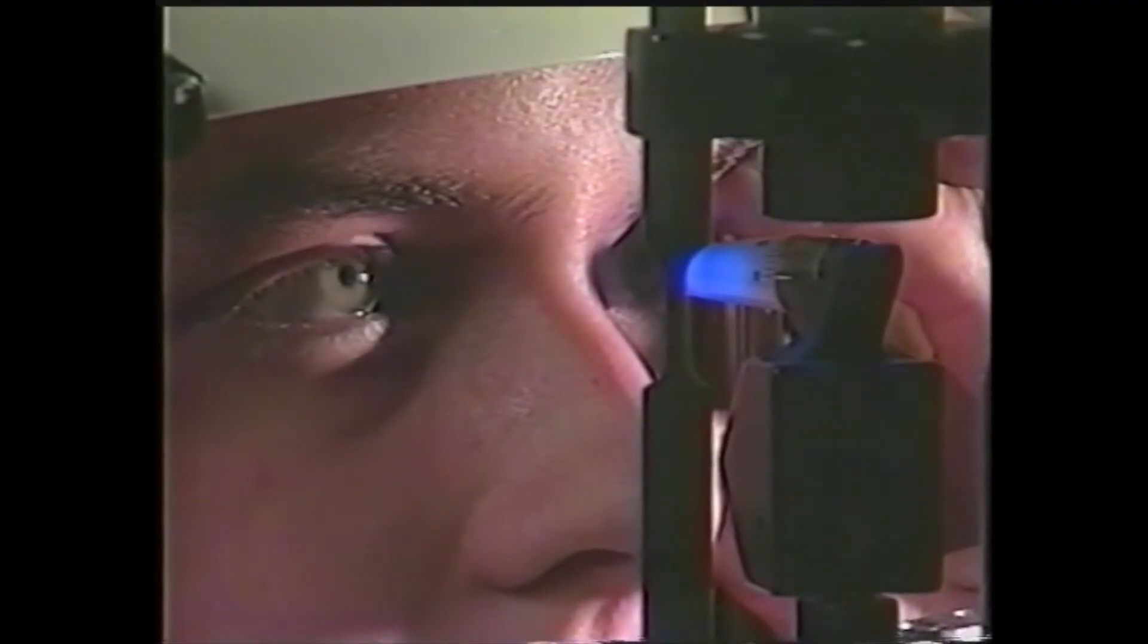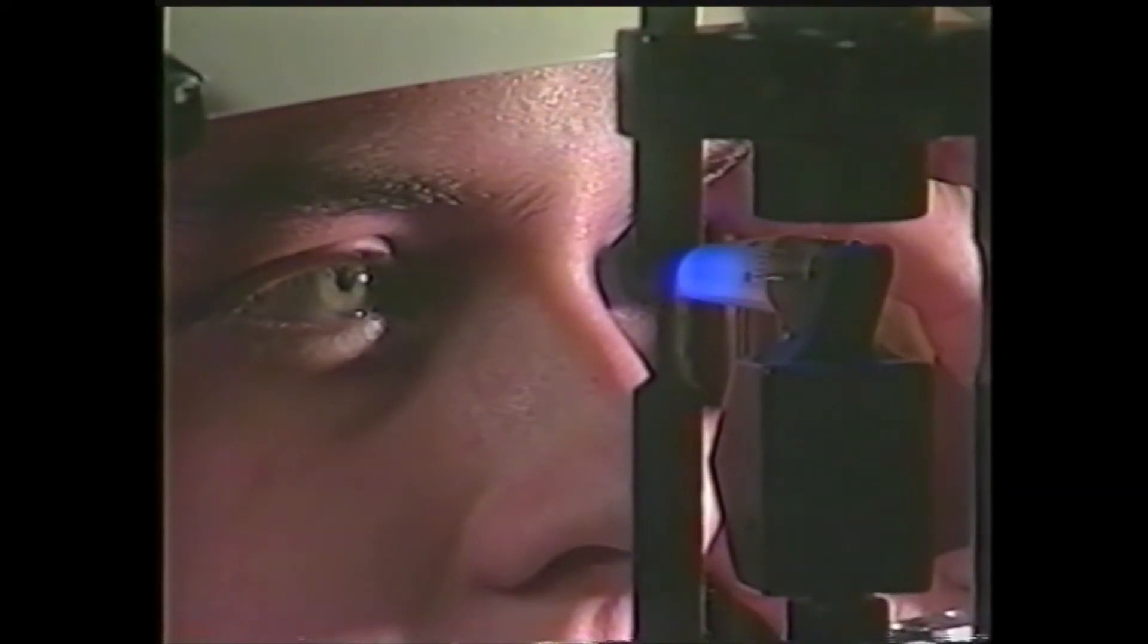At this point, have the patient look up at an appropriate target, such as your ear, as you advance the tonometer prism onto their eye.